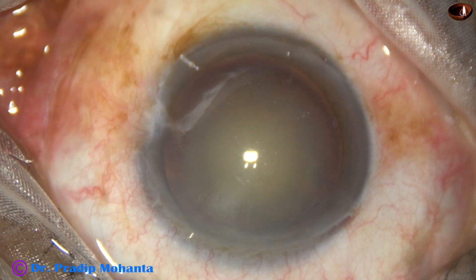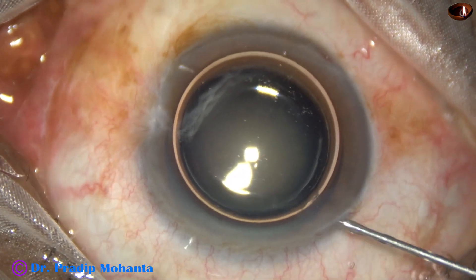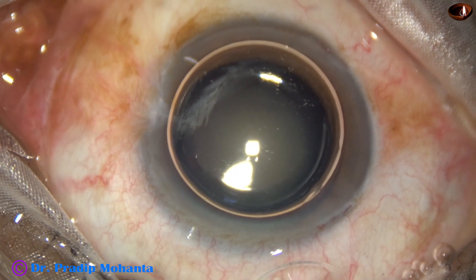A side port has been made on the right side of the main incision. In this case, my plan is to use bimanual irrigation aspiration.